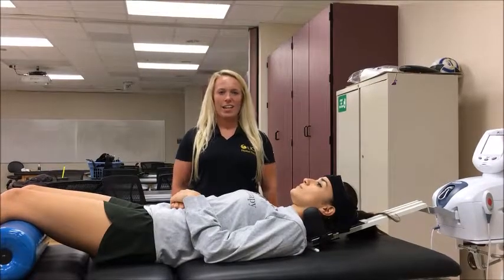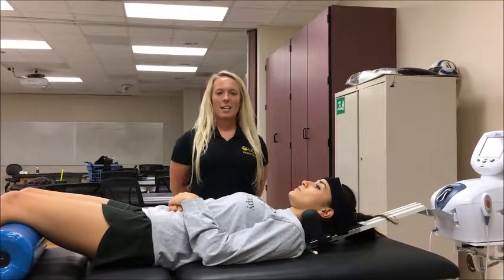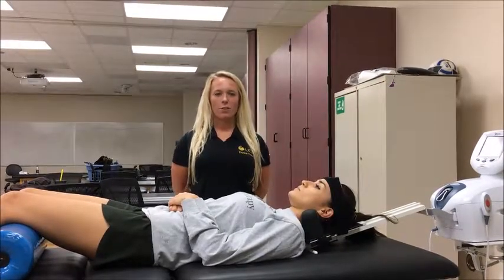My name is Ashley Kiley, and I'm a student of physical therapy. Today I will explain how to use mechanical traction for the cervical spine.